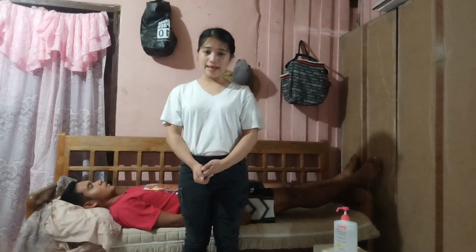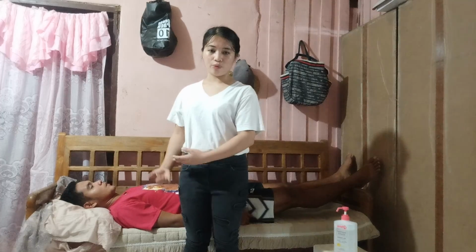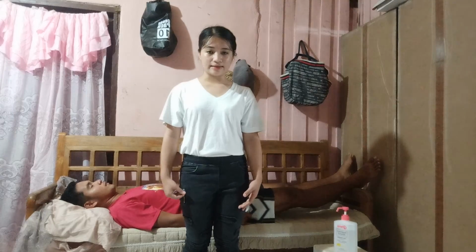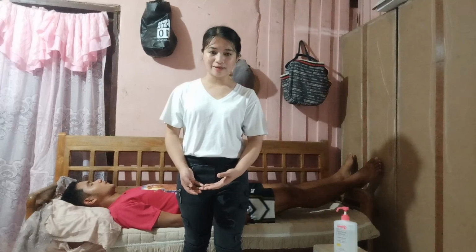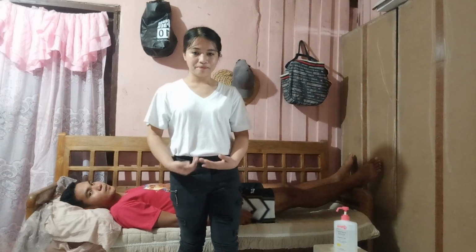So now let's proceed. For the next step, we have to position ourselves appropriately and move the client by facing the direction of the movement and then assume a broad stance with the foot nearest to the bed behind the forward foot and weight on the forward foot. Lean your trunk forward from the hips, flex the hips, knees, and ankles. Tighten your gluteal, abdominal, leg and arm muscles and rock from the back leg to the front leg and back again. Then shift your weight to the front leg as the client pushes with the heels so that the client moves toward the head of the bed.